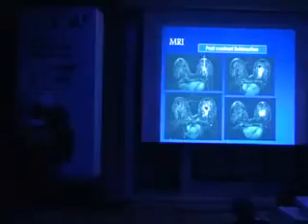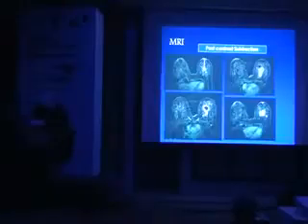Fibrocystic disease should not have this pattern of enhancement. Whenever you find this peculiar linear enhancement that is going from a nodular mass enhancing lesion directly to the nipple, and we have a cluster of enhancing nodules, yes, there are cysts, but among the cysts you may find cancer hidden there. So do not just put your probe on the breast, find many cysts and be happy.